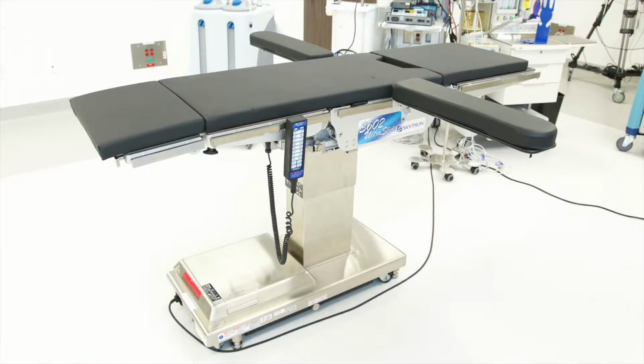Follow all requirements of the OR table used. We recommend flipping the table orientation 180 degrees when possible, so the long portion of the table base will be situated under the patient's center of gravity. This usually provides maximum stability. Ensure there is adequate clearance for the C-arm to maneuver into place.